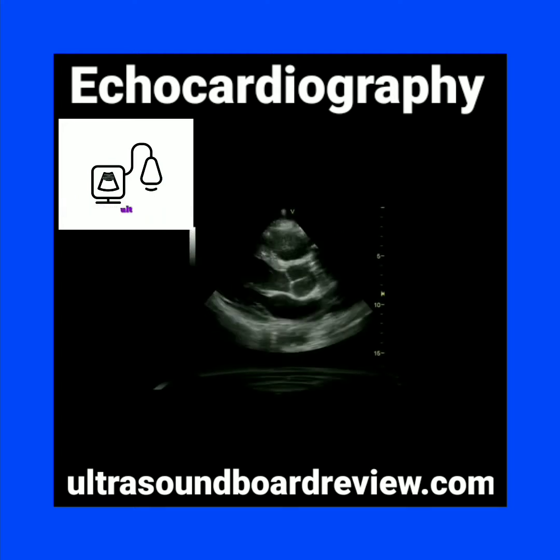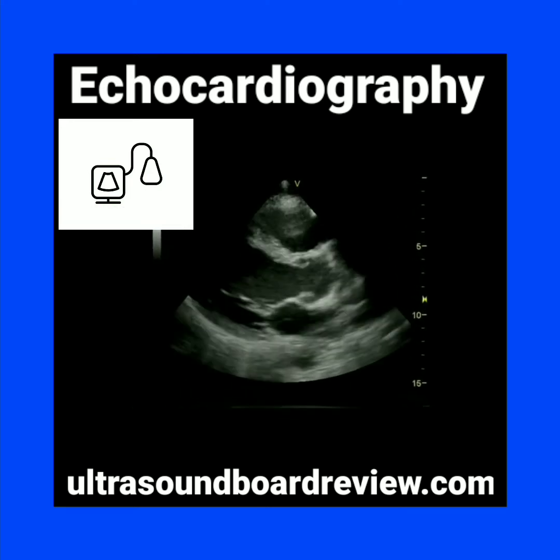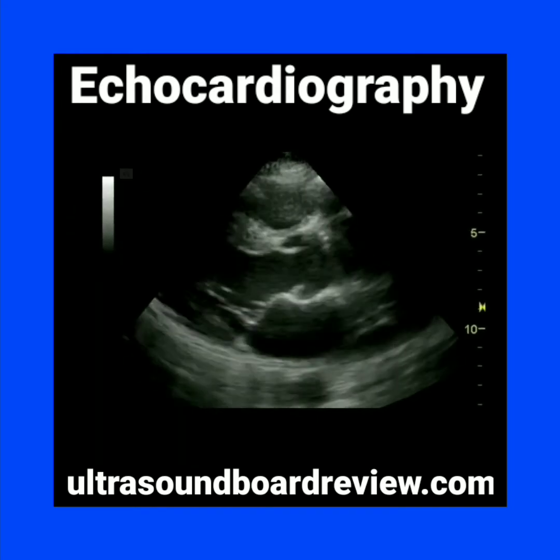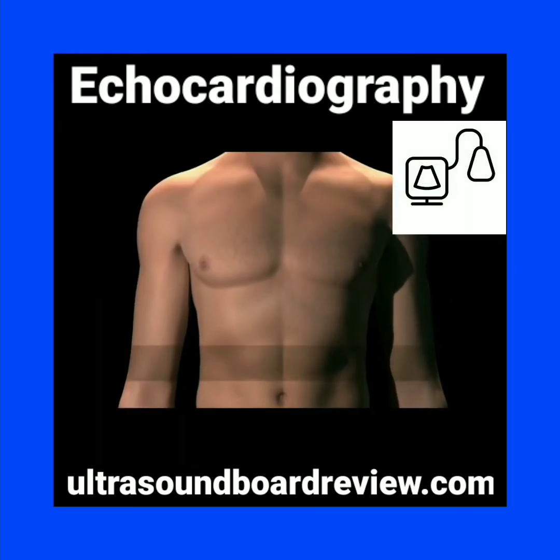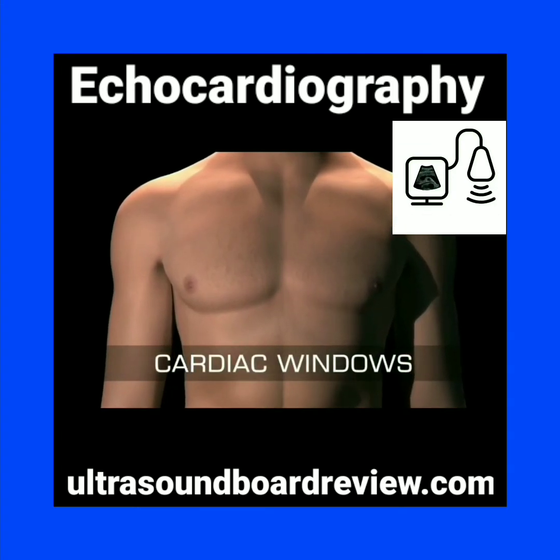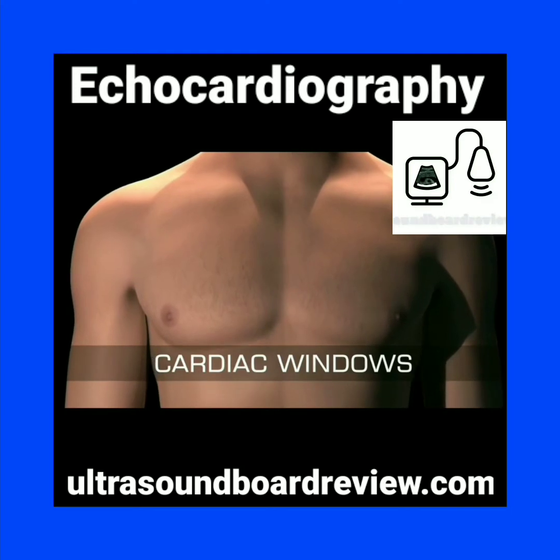Ultrasound is an effective, non-invasive imaging modality that can be used to assess the heart for a number of cardiovascular disease processes. The term cardiac windows refers to areas on the anterior chest wall through which the ultrasound beam can effectively reach the heart without being blocked.